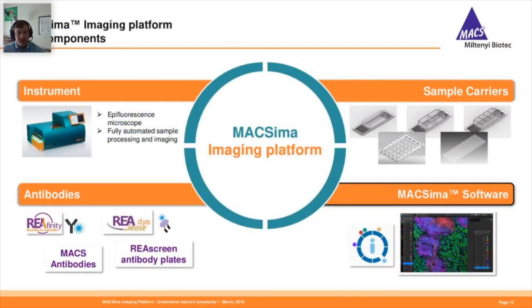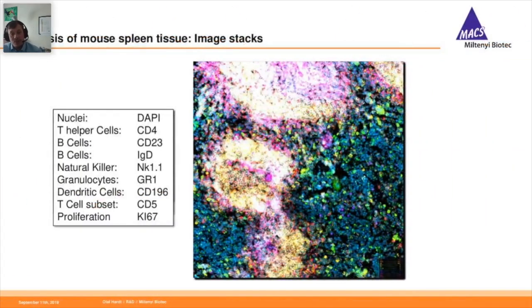So we've been through the instrument itself, which is applying these antibodies in a completely automated fashion, and we've got ways of putting our samples in, and we've talked about the antibodies and ways we can disrupt this staining. And then the fourth part, which is almost the most complicated bit, we're talking about the software here. As you can probably imagine, if you're talking about hundreds of markers from any sample, looking at it in just a standard 2D image, once you get beyond 9 overlays, you're starting to lose any idea of what the data could be and how useful it might be.